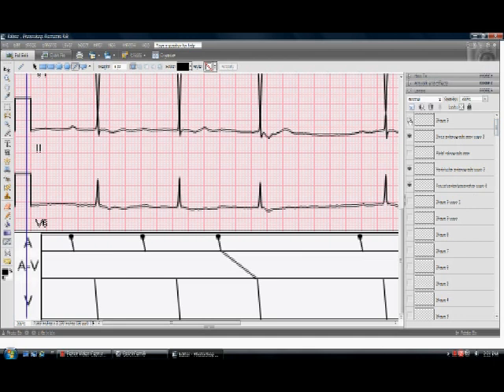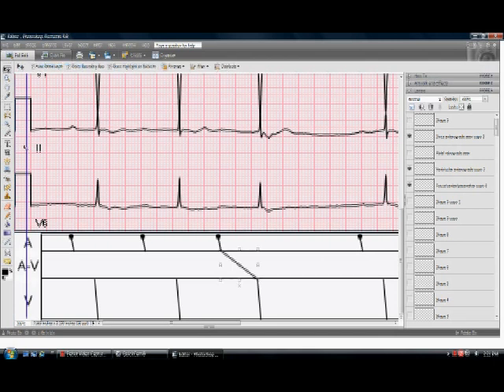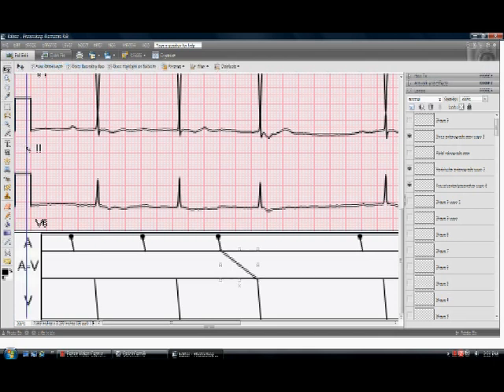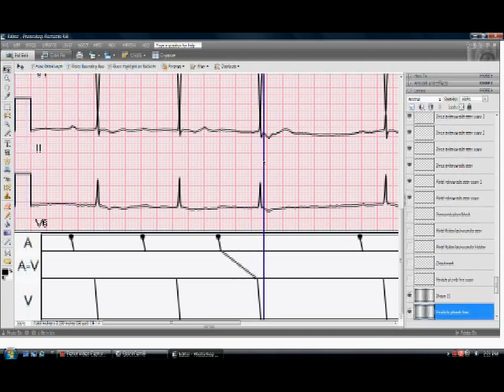To that, I would need to add, before I do that, I'll show you, take the plumb line again, put it right over here at the beginning of this retrograde P-wave here in lead two.